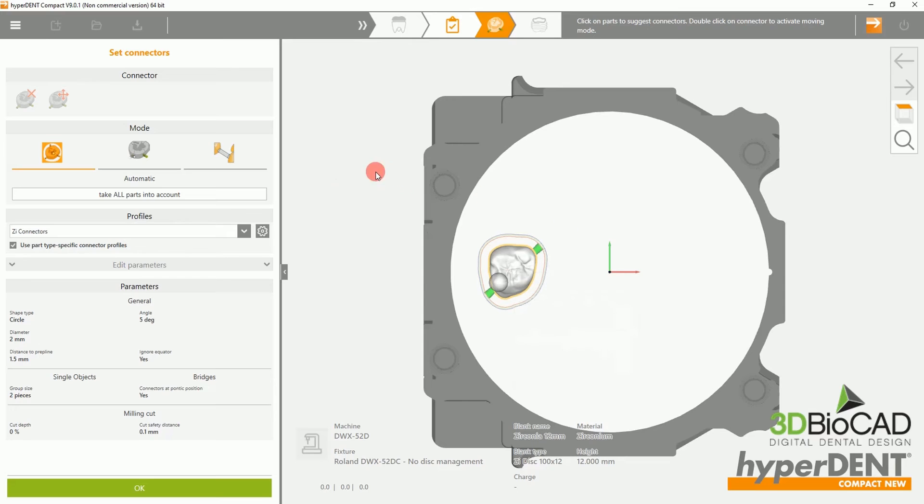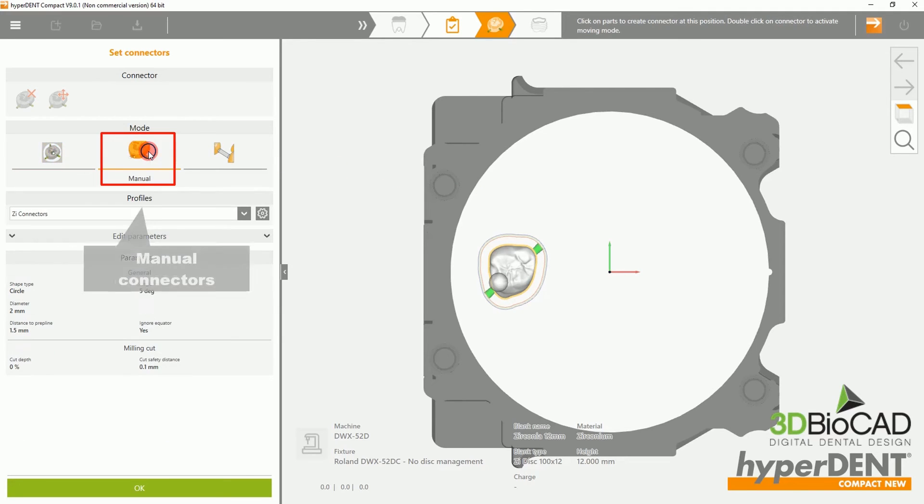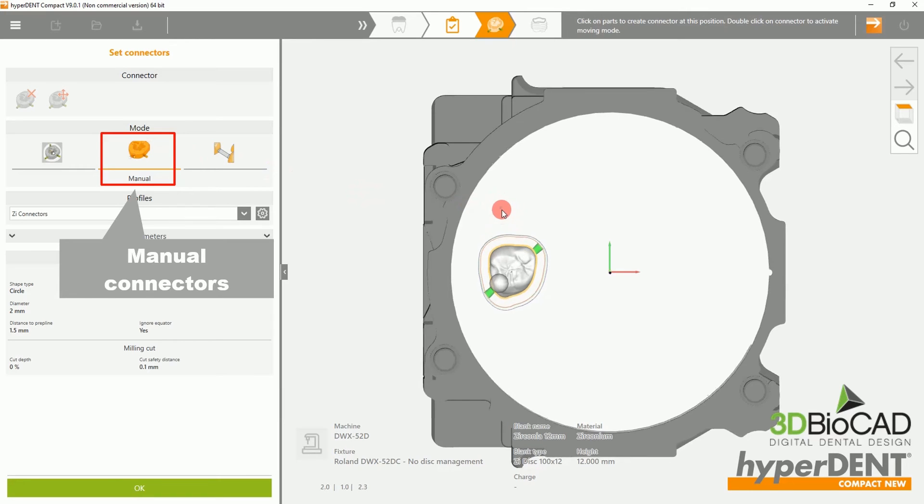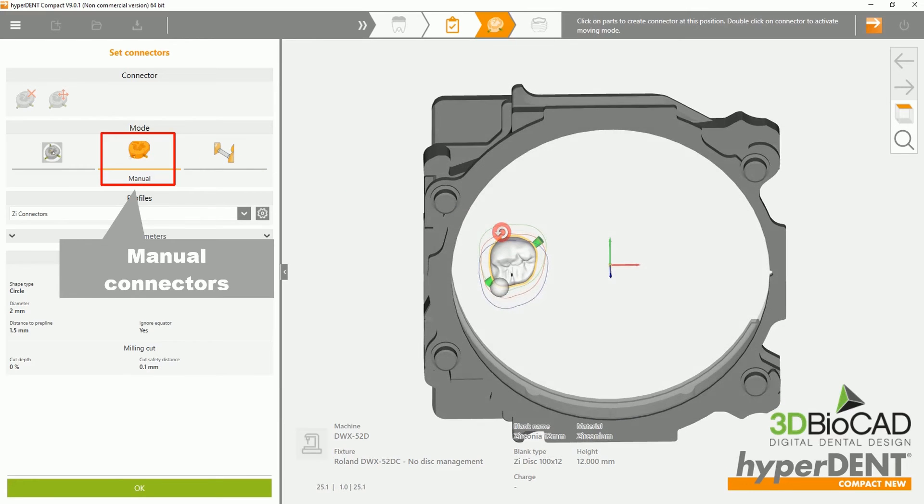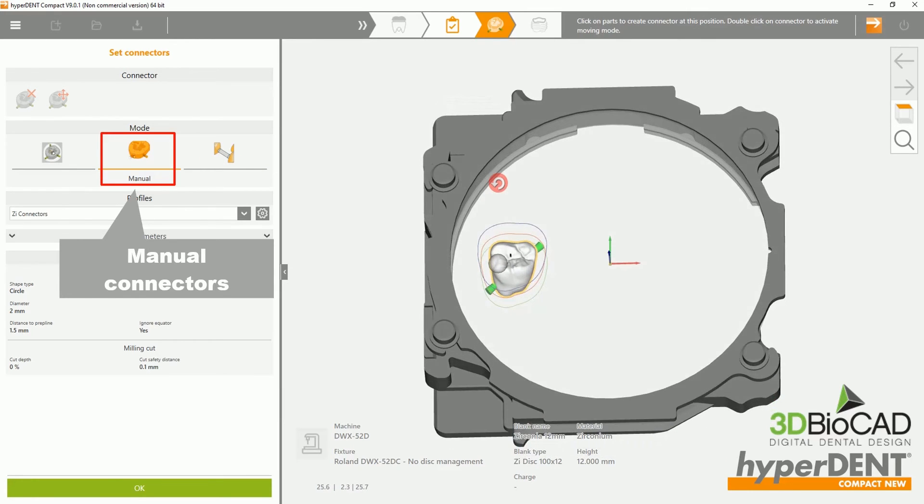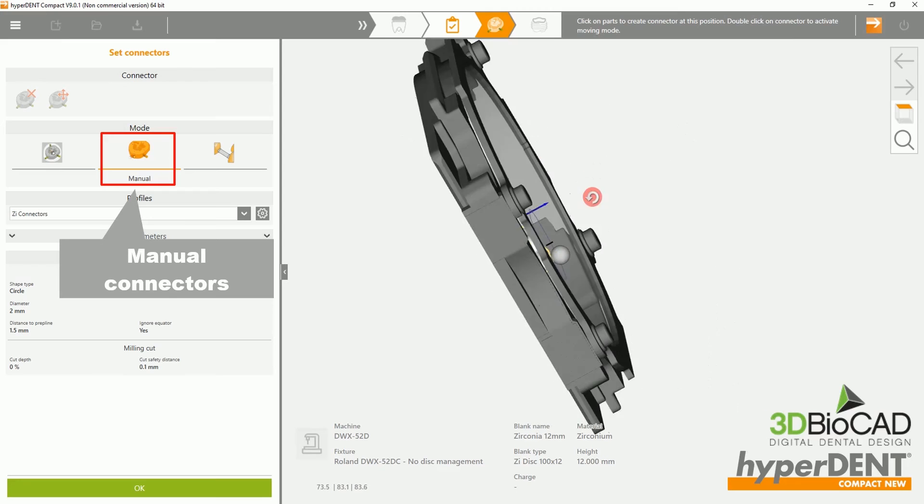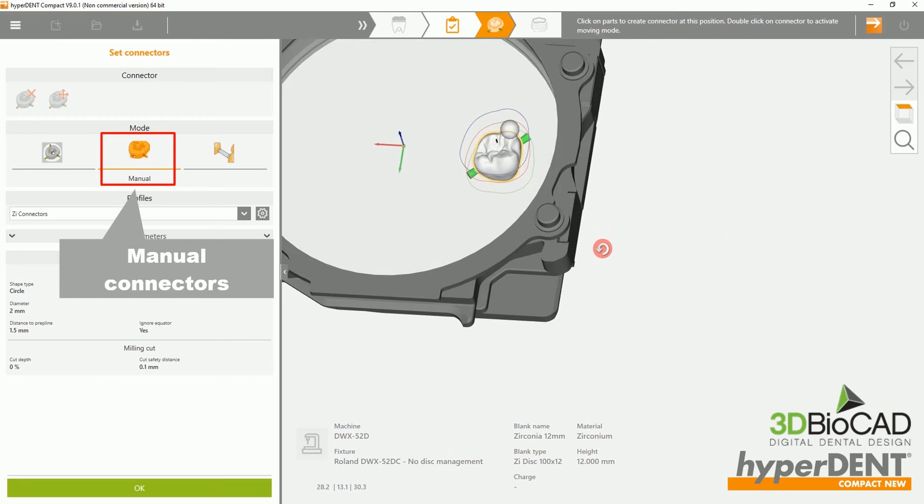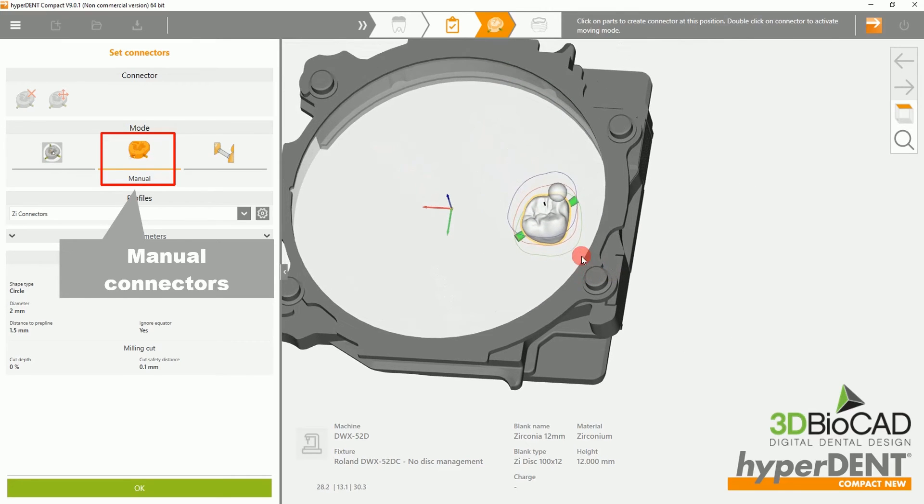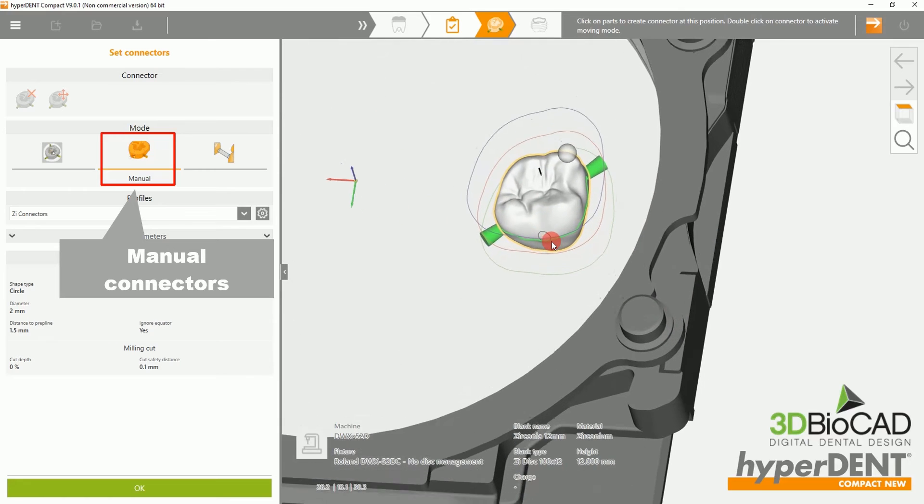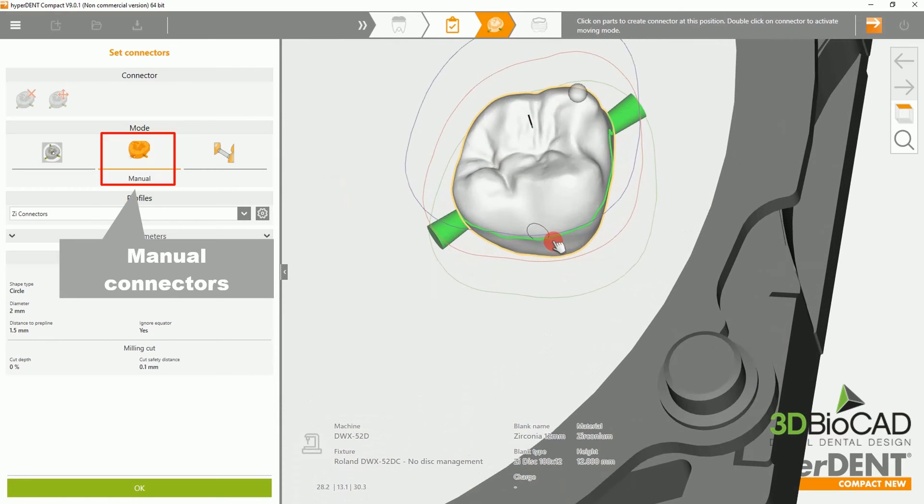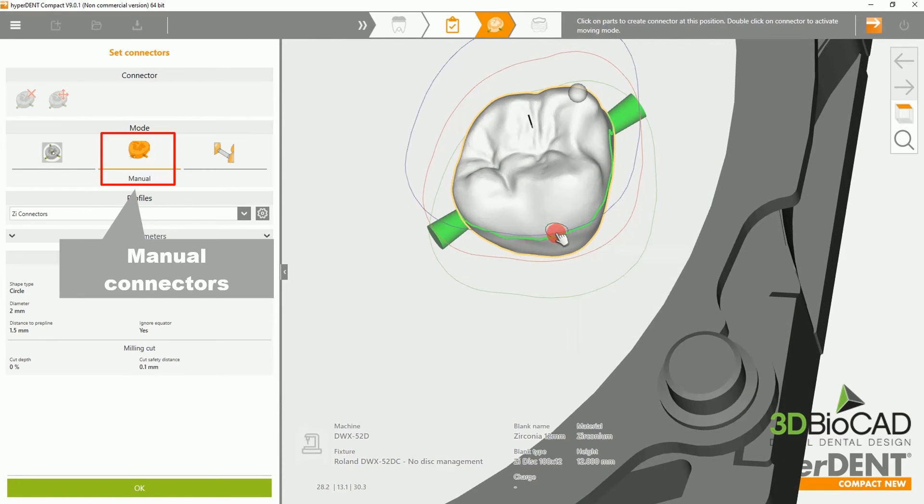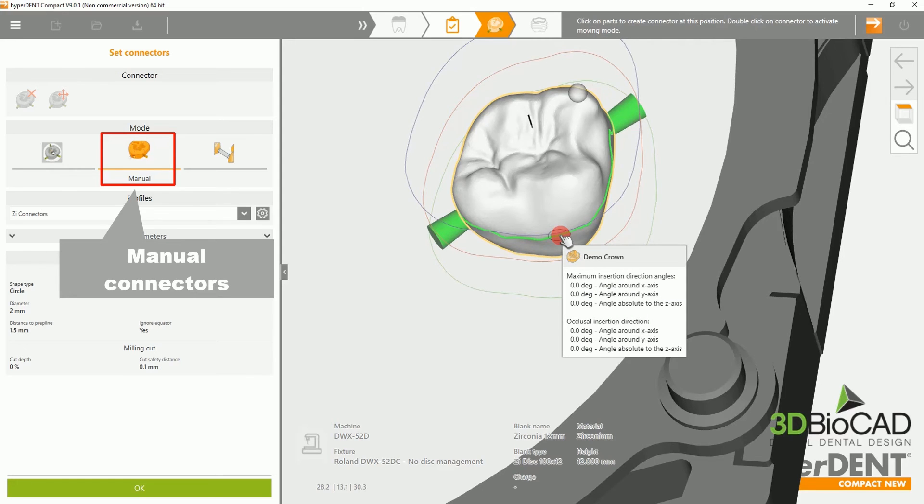To manually add connectors, please select the Manual option. Then, rotate the fixture and add connectors wherever desired.